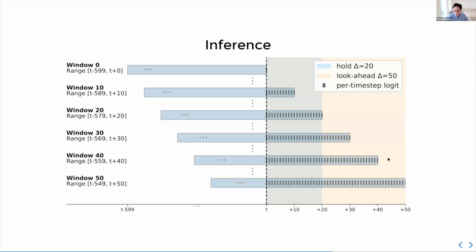A question. Yes, please. I wonder if it's possible to add an accelerometer to detect if the user is moving their hands and to deal with edge cases. Yes, great point, and we should definitely have other sensing modalities. The Myo armband itself actually has an IMU, but as we know, IMUs are very noisy. If you try to integrate, the drift is insane. So I think we should integrate more sensors, like accelerometers and other modalities.